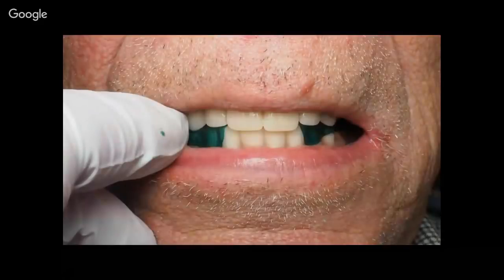Now, a little extra tip. In the last case I showed you, to analyze the occlusion, we had the digital remounting pins. But suppose that you didn't do that and you just wanted to go straight to delivery. Anytime you deliver a denture, regardless of how you generated it, the problem with checking denture occlusion is this: let's say there's a tooth in there that moved a little bit and now there's a prematurity, sticking up 0.5 millimeter beyond all the others to prevent a good bite. What happens is the patient bites down and then they hit that prematurity.